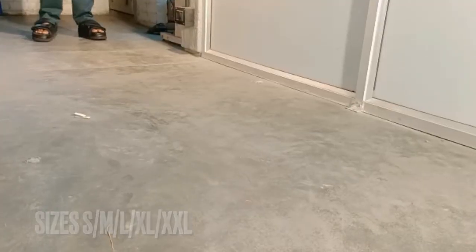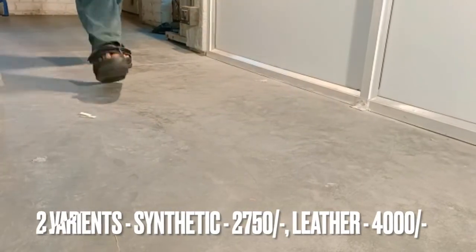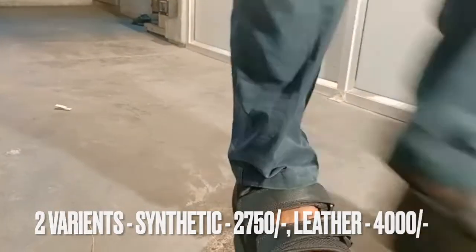The wound management system is ready and the patient walks with the required solution in just 10 minutes.